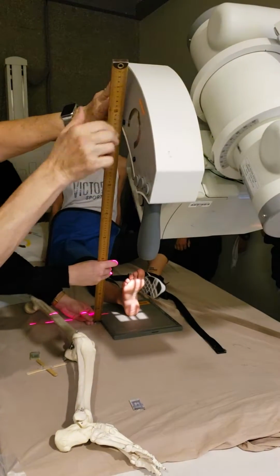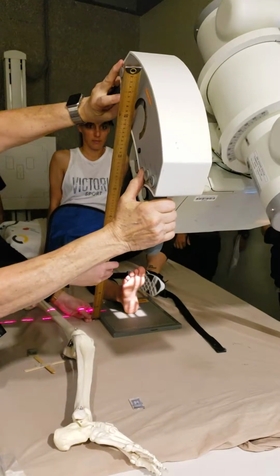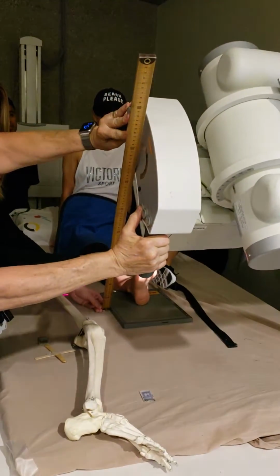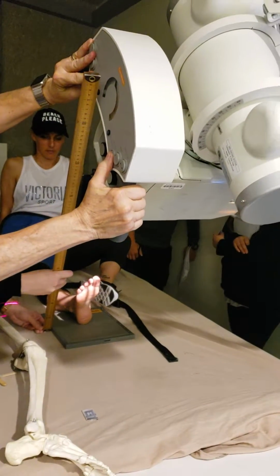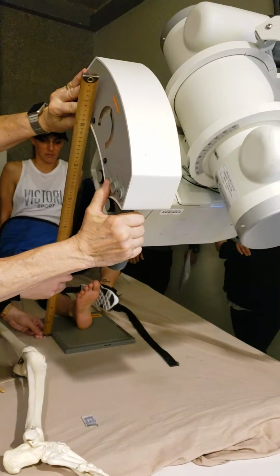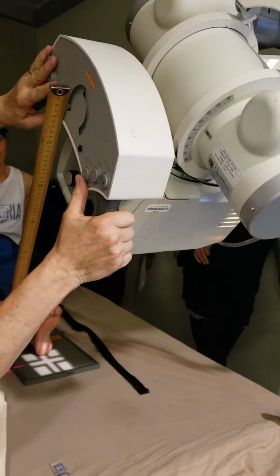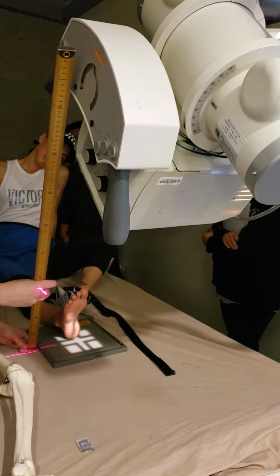Okay, and then what you have to do is, it's really hard to do with one person, but you hold the lock release and you go diagonally. See how I'm pushing it diagonally? Not up, not down. So I'm going this way. See how the tube's going at a diagonal? Not just up and down, but both. That way I'm getting my 40 inches set here. Make sure I didn't change that. So this doesn't change now. I'm centered to the middle of the cassette.